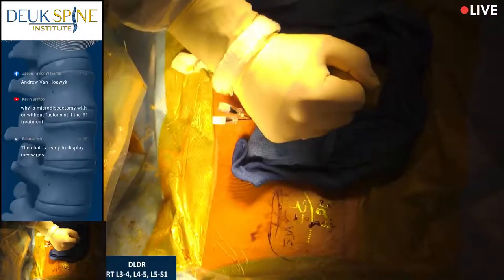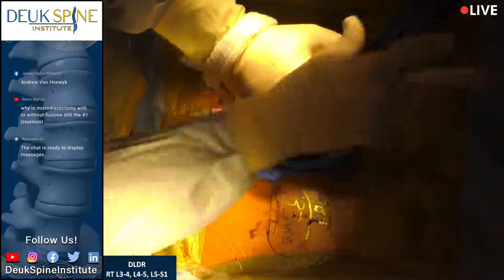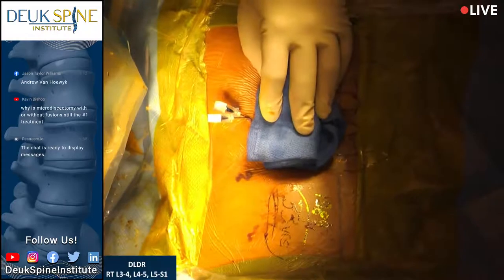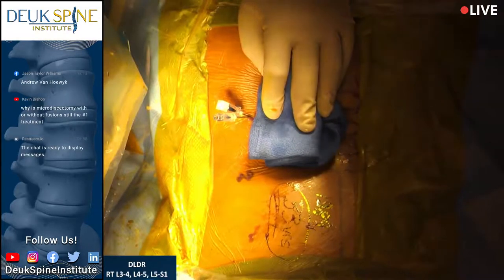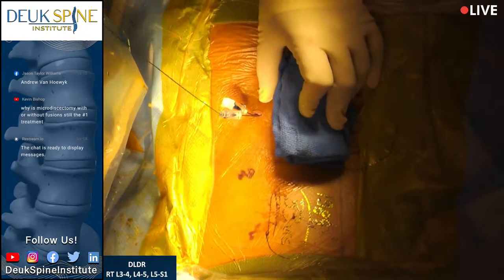Welcome back. We have just finished the Deuk laser disc repair on L5-S1. And we're going to get started at the next disc, which is L4-5. And then we'll finish up at L3-4. So we've already made our incision at 7 millimeters.